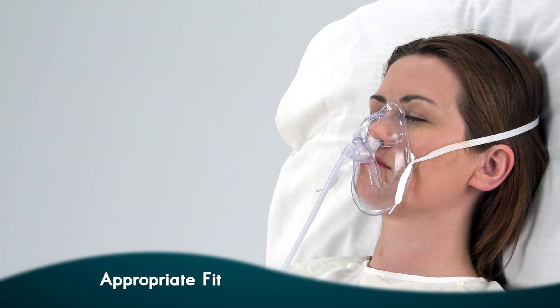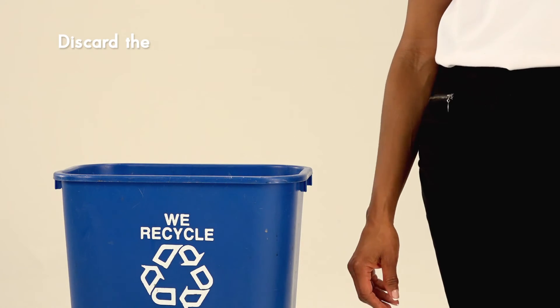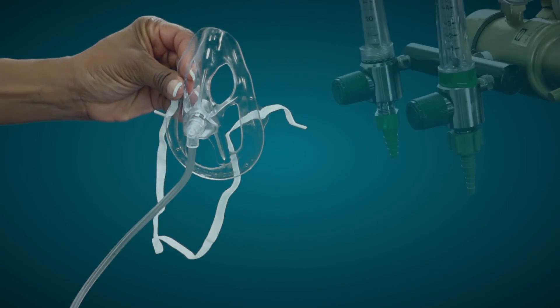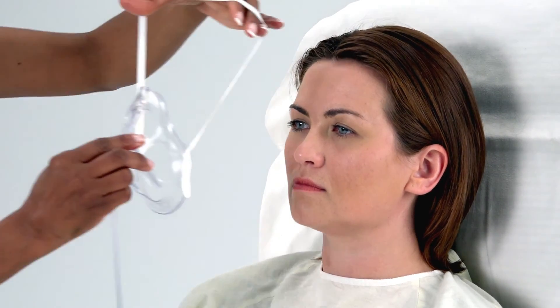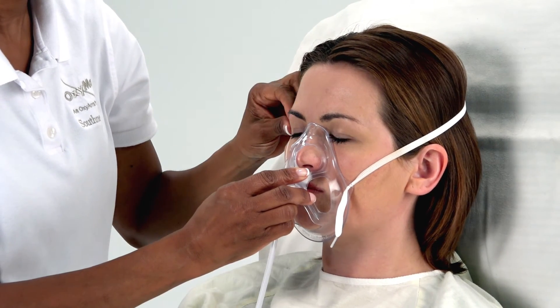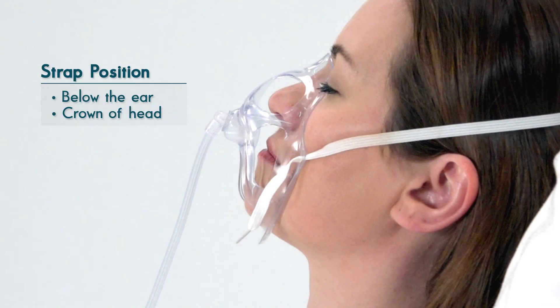When using the OxyMask, proper positioning and fit is important. An appropriately sized OxyMask will fit below the eyes and cup the chin. Remove the OxyMask from the packaging. Recycle or discard the insert inside the mask. Gently rotate the swivel elbow to release and achieve the desired tube position. Attach the universal connector at the end of the mask tubing to an oxygen source. Place the mask on the patient's face with the swivel and diffuser pin assembly centered below the nose and above the upper lip. Position the elastic strap below the patient's ear or at the crown of the head, maintaining comfortable tension. Avoid pressure on the ears.